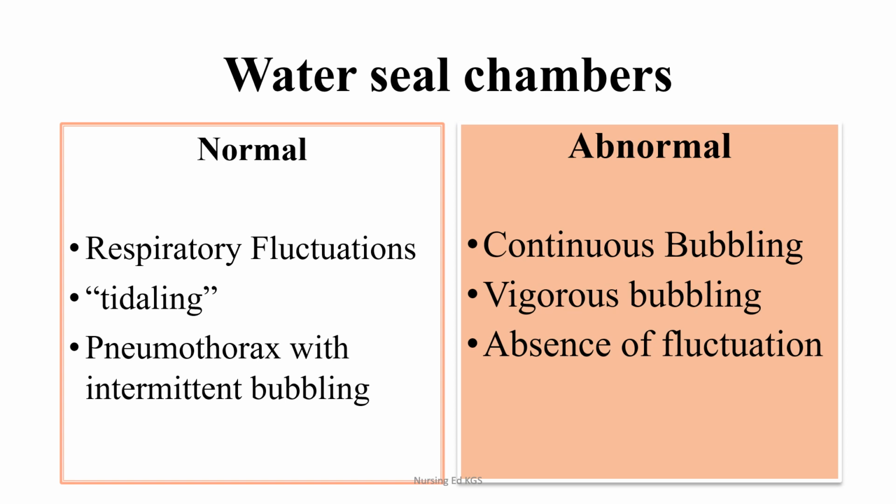Continuous bubbling in that water seal chamber may indicate that there is an air leak in either the patient's thoracic cavity or some possible tube disconnection.